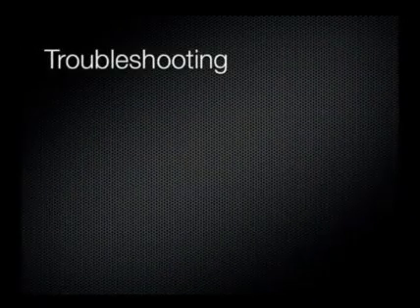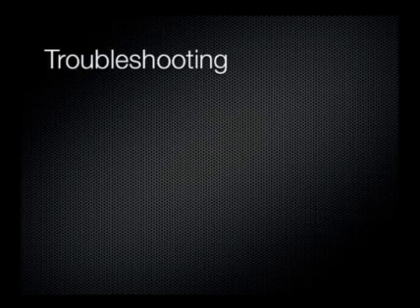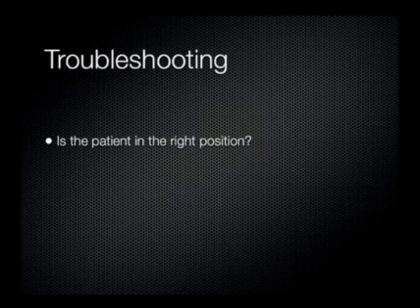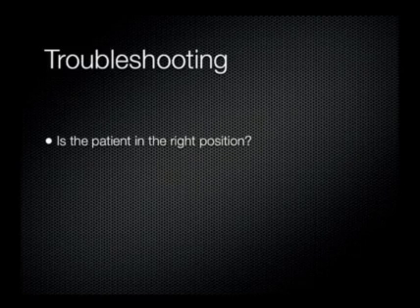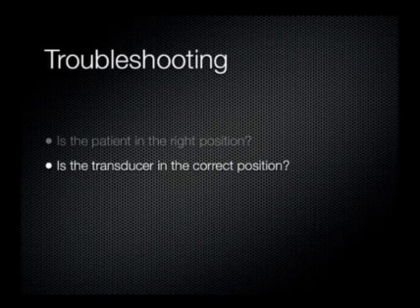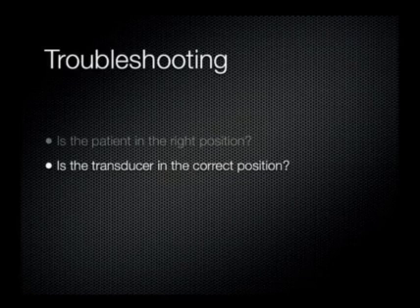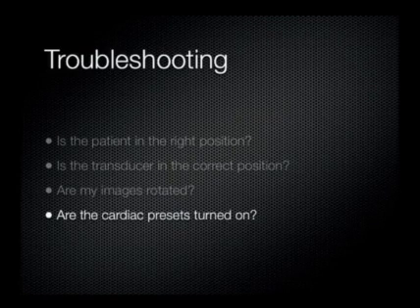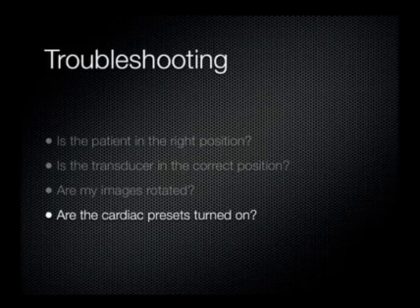When performing a cardiac exam, if you're having trouble obtaining correct images, keep these questions in mind. Is the patient in the correct position? Oftentimes, you will obtain a better image if you place the patient on his or her left side with the head of the bed elevated to about 20 to 30 degrees. Is the transducer in the correct position? Try sliding the transducer under and over the ribs to obtain a better acoustic window. Are my images rotated? Your transducer may be in the correct place, but the probe marker may not be. And if your images don't appear crisp, make sure you are on the cardiac presets on your ultrasound machine and not the abdominal presets.